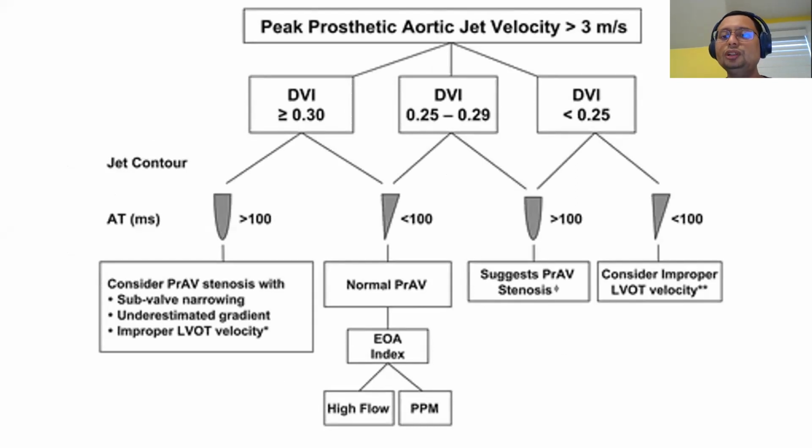So this patient, again, velocity is more than 3. However, DVI is less than 0.25 and acceleration time is more than 100. That is true valvular stenosis.